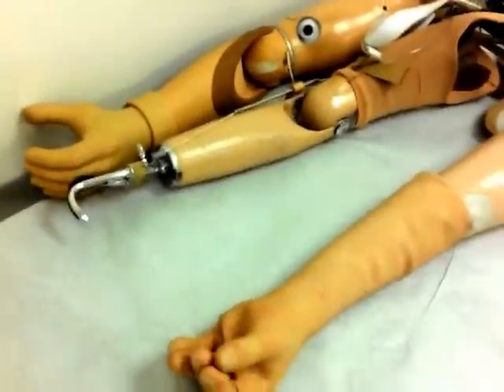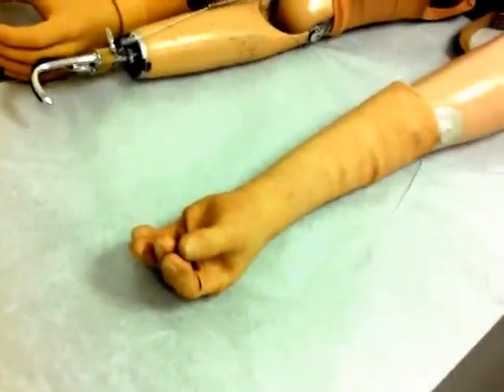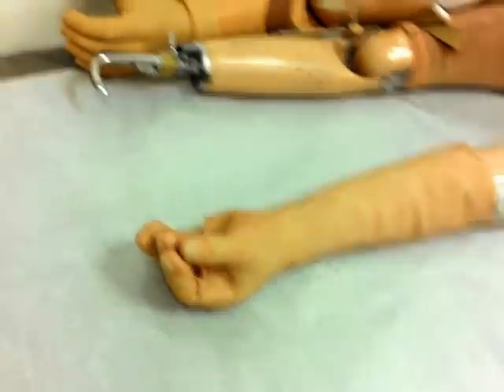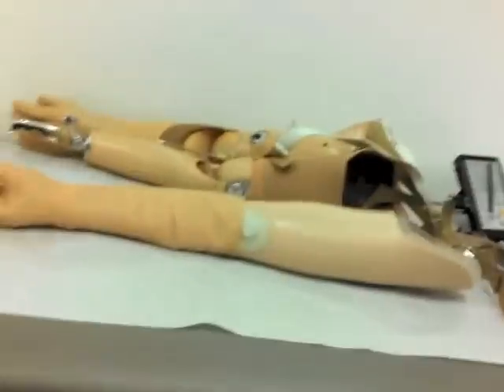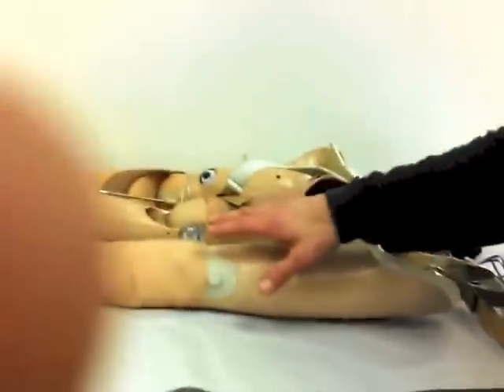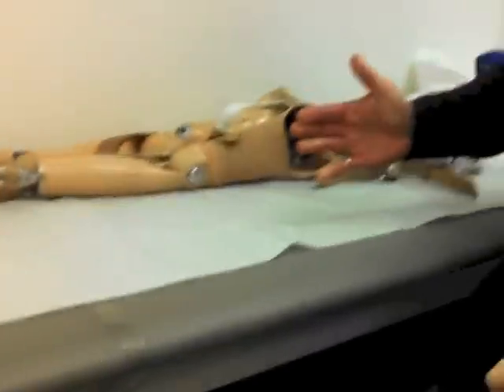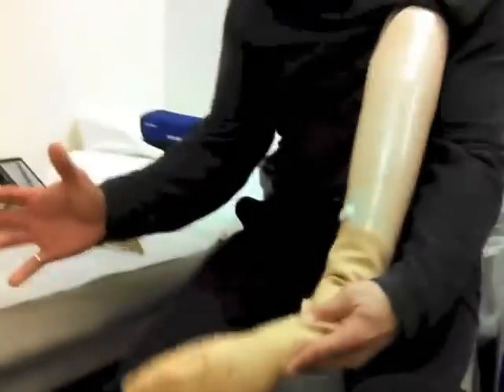She said she feels like a creeper. The passive prosthesis is basically a device to help you hold something together. You can grip it together, but you're not going to be able to hold anything with this much. If you put your finger in here, it's basically about one or two pound pinch force — it's not much.